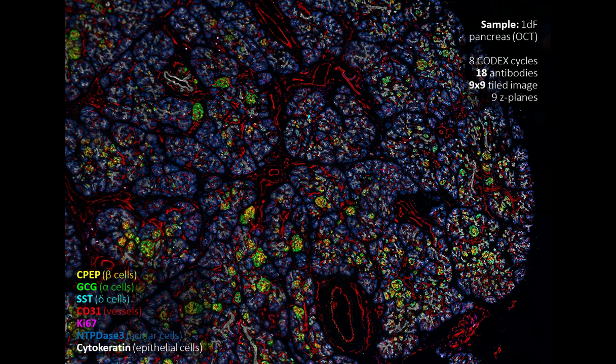So this image here is a representative of one of our tissue sections that we're interested in learning more about. This sample actually comes from a donor that died very soon after birth. So this is really the kind of mid-development of a pancreas. And I mentioned before this tissue was fixed lightly in PFA prior to embedding and freezing in OCT media. And then the kind of experimental outline of this image is listed in the top right-hand corner.